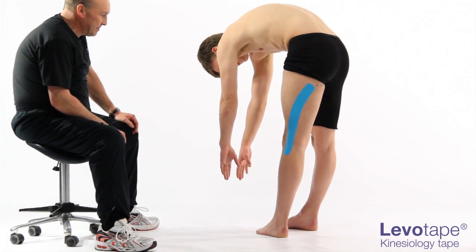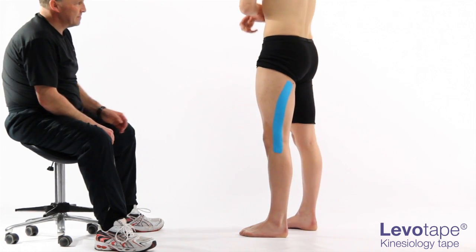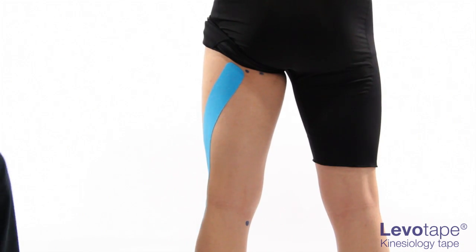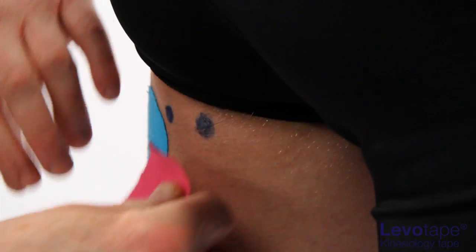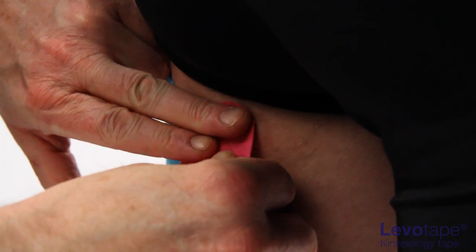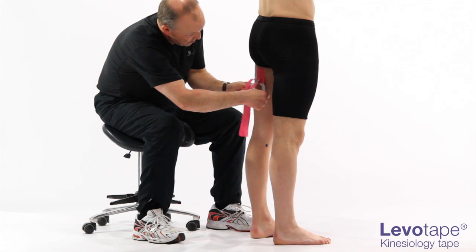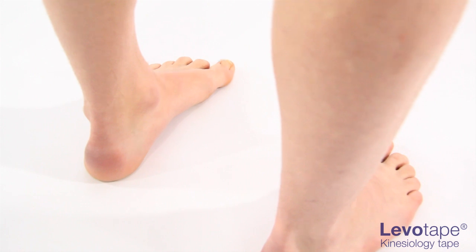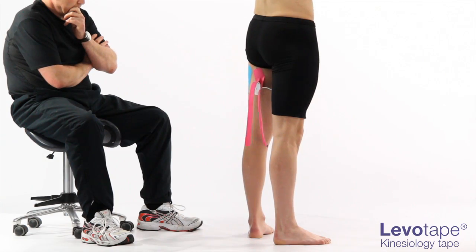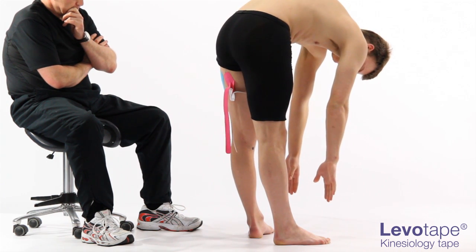Return the patient to neutral. Next, apply the Y strip. Lay down 3 to 4 centimeters of tape as an anchor at the base. Instruct the patient to externally rotate the hip joint, flex forward at the hip while maintaining full knee extension.